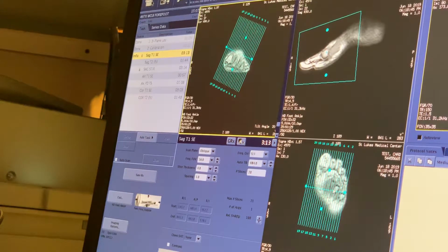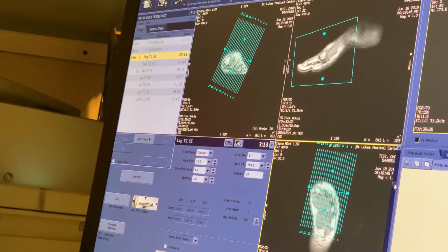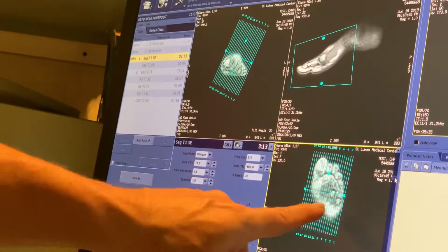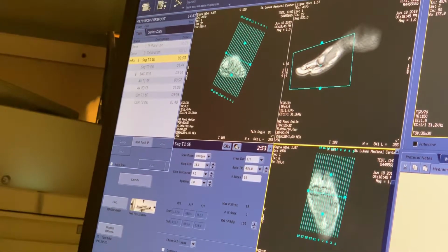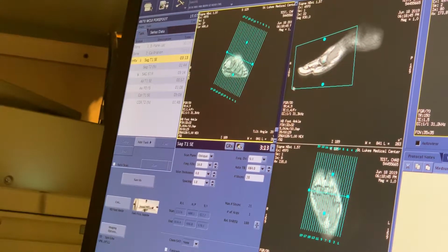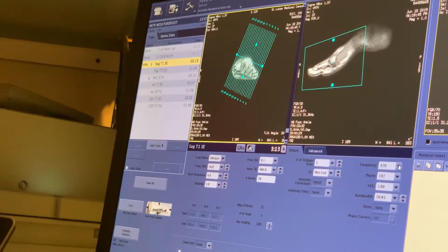It doesn't matter which one you go to, whether I moved it a little bit more anterior here. So you just go through either the axial or the coronal, and you want to make sure you cover from skin to skin. So there's the skin and you have to scroll through to make sure that you've got the skin. So I've got the skin there, and the skin comes to about there, so I'm going skin to skin. And if I see it here and go, well, there's a little skin there, I might add an extra slice just to make sure I cover it, because you don't want to clip. Because especially if it's a skin infection, the last thing you want to do is cut that anatomy off the scan. So that's what I'm looking for right there.